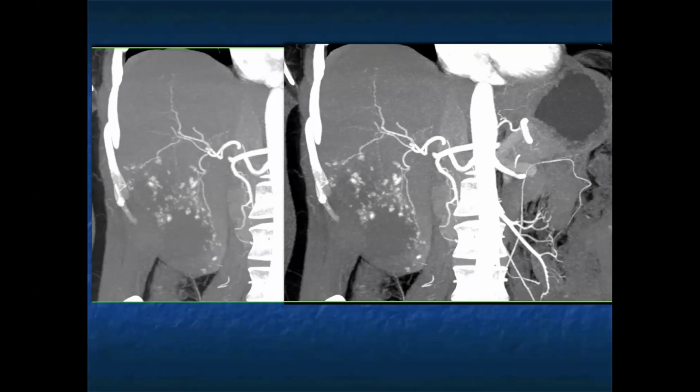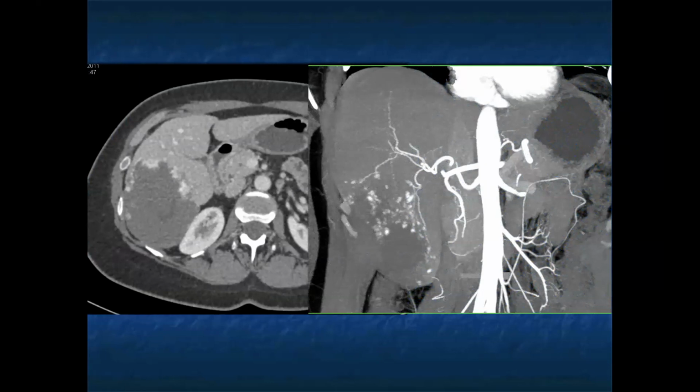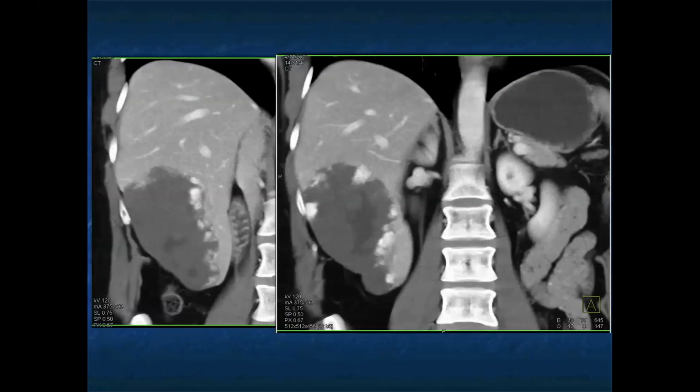With hemangiomas, particularly when they're large, you can at times see feeding vessels going into them, but more typically it's to the edge of the lesion. At times, the feeding vessels can be a bit large when you have very vascular hemangiomas, but they're never irregular like you see with malignancy. And as you go and follow the lesion downward, the lesion fills in. Now, with larger lesions, fill-in time can really take up to 30 minutes, and we don't follow the patients. But from this appearance, I know we're dealing with a hemangioma, and I don't need to do anything any further than this. And again, here's just some nice images.